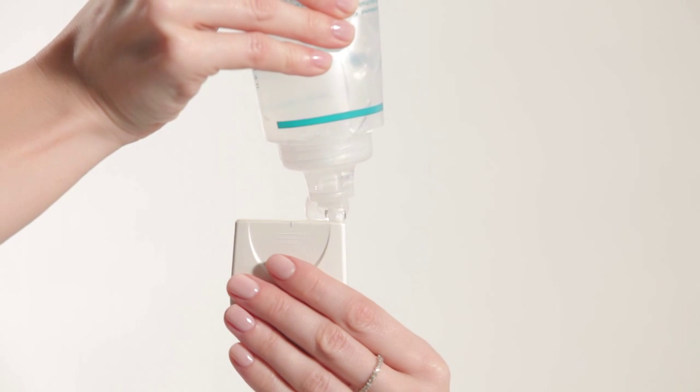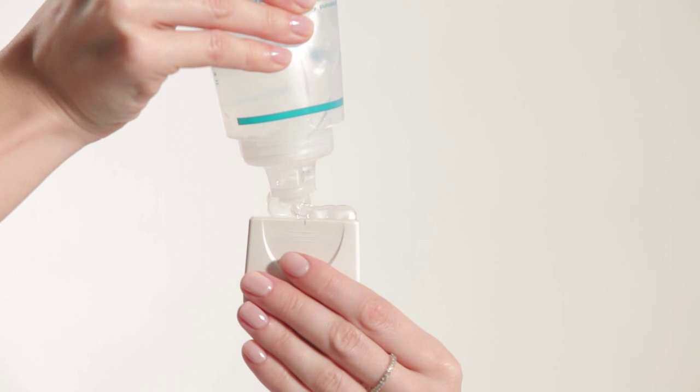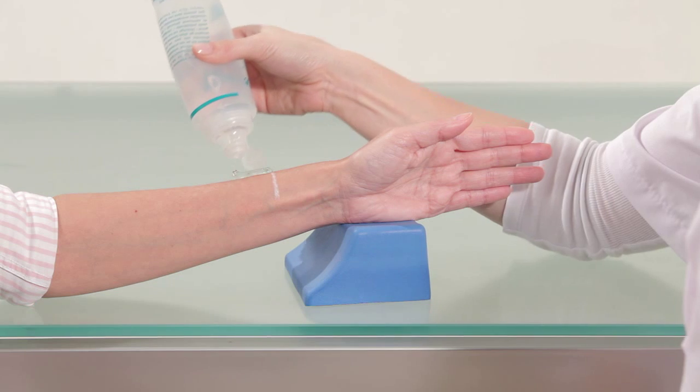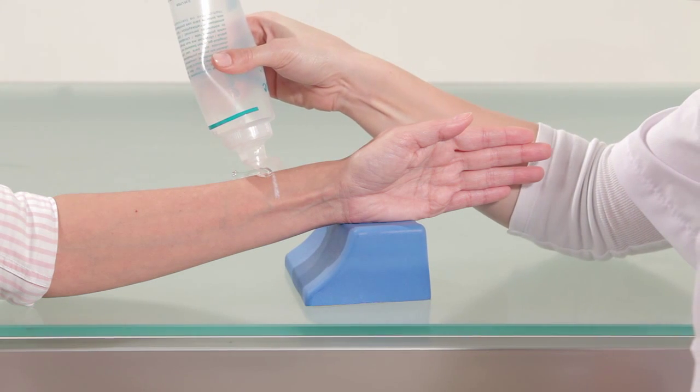Apply a uniform layer of ultrasound gel on the outer surface of the probe, and on the subject's arm next to the line.